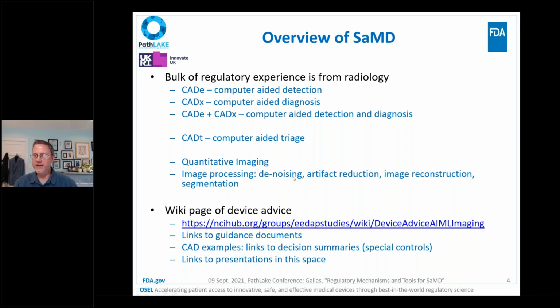And then a really interesting area is using artificial intelligence for image reconstruction and noise reduction. I never would have thought that that would have been a use case, because I'm so used to the math and the physics related to the image formation process. But now they're throwing a lot of that away in some spaces to do image reconstruction by deep learning. It's pretty amazing. And obviously segmentation is a big tool in artificial intelligence.